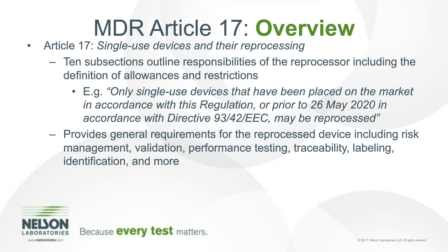The MDR also imposes timelines related to cutoff dates, such as in Clause 6, which states that only single-use devices that have been placed on the market in accordance with the regulation, or prior to May 26 of 2020, may be reprocessed. Overall, the content in Article 17 and the MDR in general for single-use device reprocessing can be considered a significant step in the right direction for reprocessors, again providing regulation to ensure safe and effective reprocessed devices make it to the market.